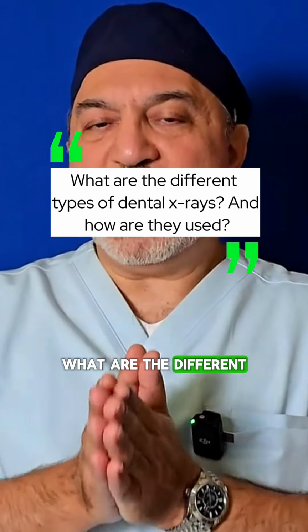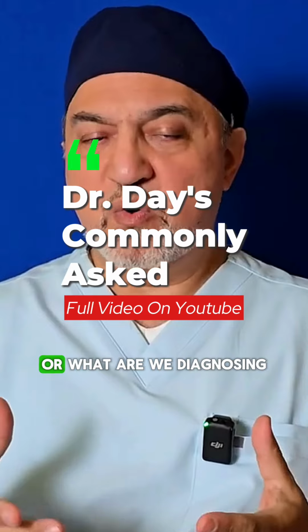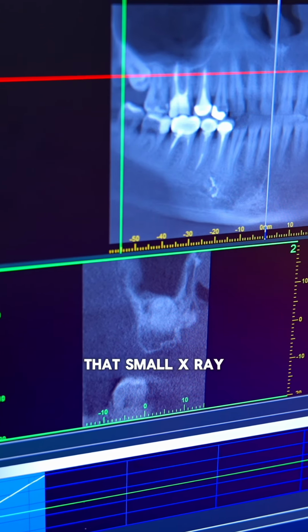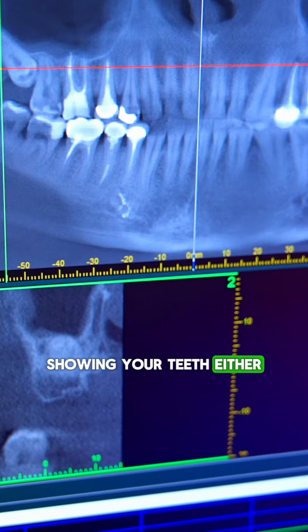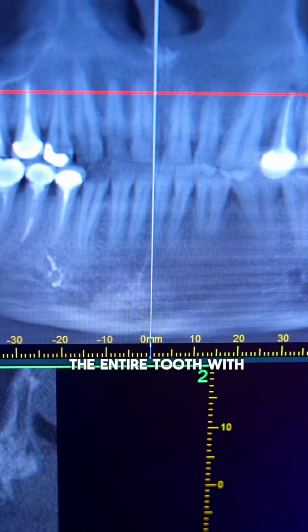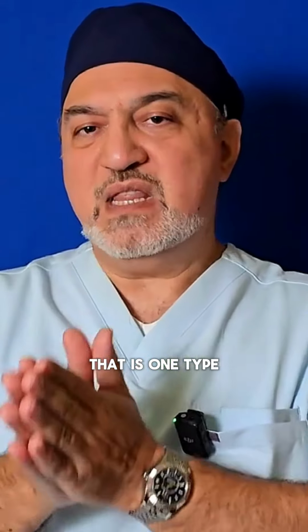What are the different types of dental x-rays and how are they used? Depending on the purpose, or what are we diagnosing, right? What is the problem that the patient has? It could be a small x-ray. That small x-ray will be showing your teeth, either the teeth coming together and it shows both of the teeth, the coronal aspect of it, or it can show the entire tooth with the root and with the bone around that root. That is one type of x-rays.